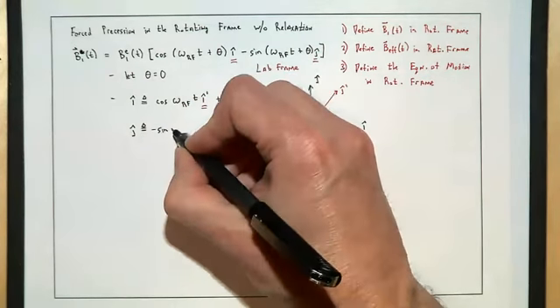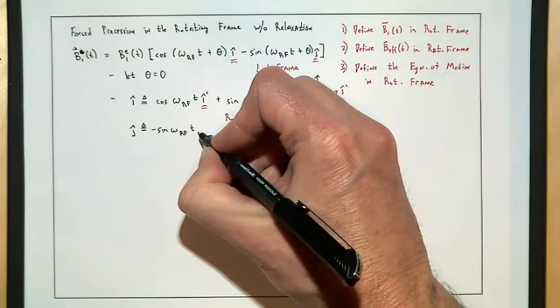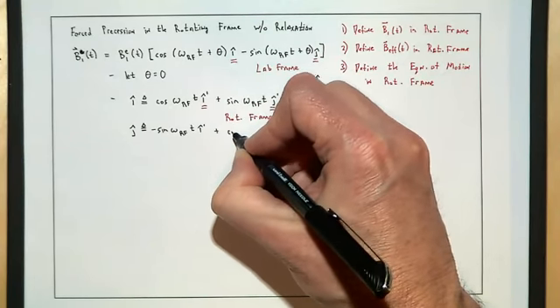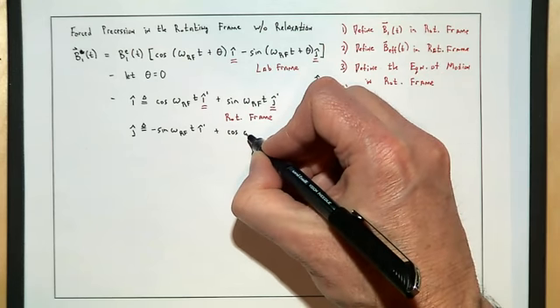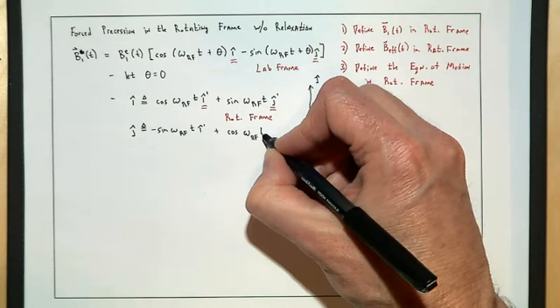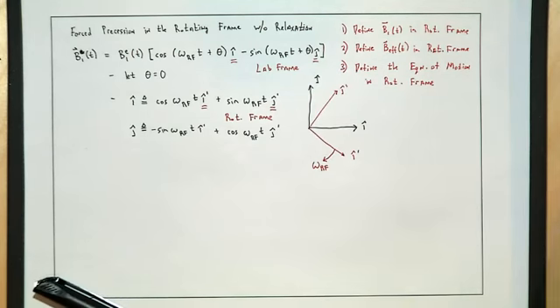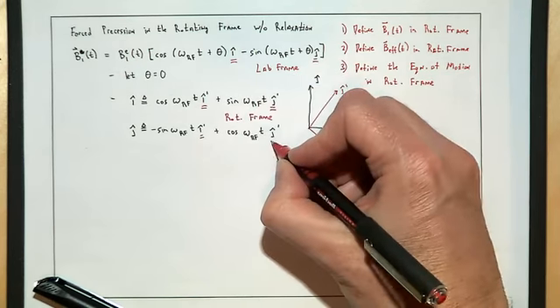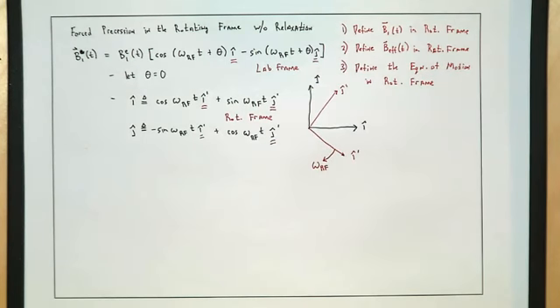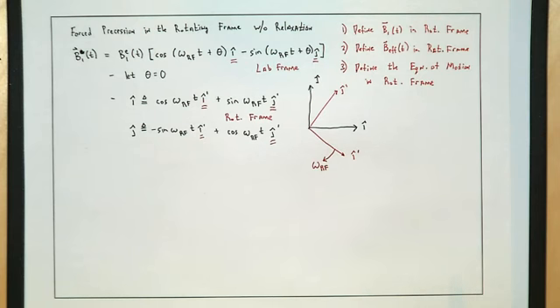If you can't tell yet, I really like rotations. If you look at the sine and cosine terms inside of here, this is just another rotation about another axis. And again, you can see those rotating frame directions popping up again. So all I'm going to do is substitute these into the first expression we had for B1 of t.